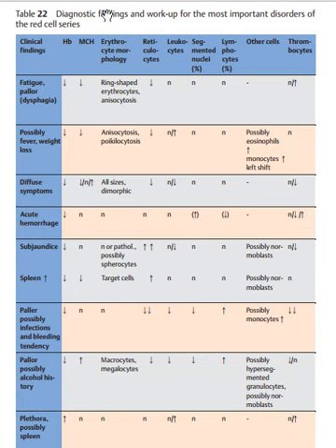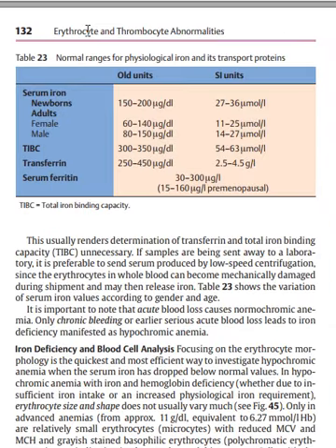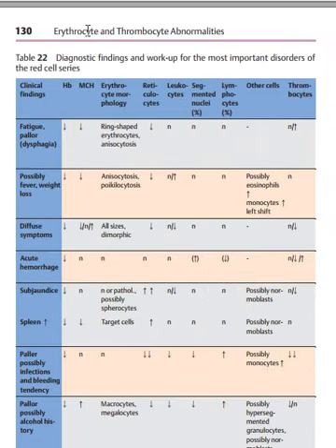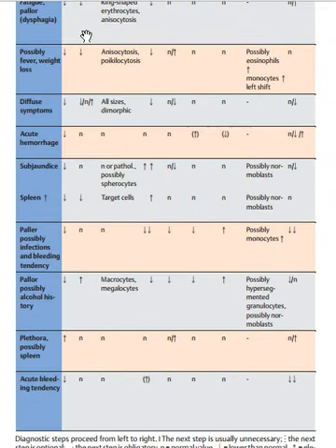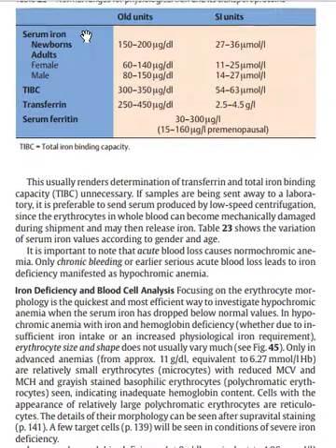So this is a diagnostic finding and the workup of important disorders of the red cell series. So I'm not going to speak about that. So you can pause in order to visualize the different elements. So this is it. You can pause to visualize the different elements.